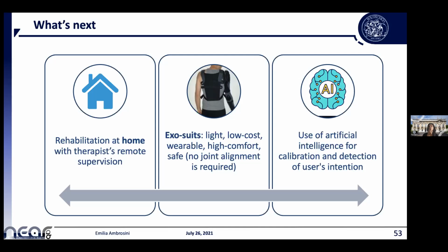So this could be done before and after without FES. I think that EMG in FES application could be useful both as an assessment and also during the intervention in order to evaluate the real involvement of the subject. In this case, it's a little bit more challenging since we need to include specific filtering of the EMG signal in order to cancel the stimulation artifact.